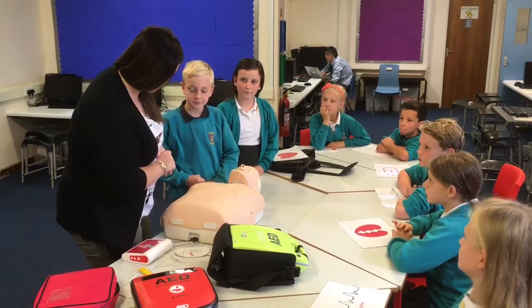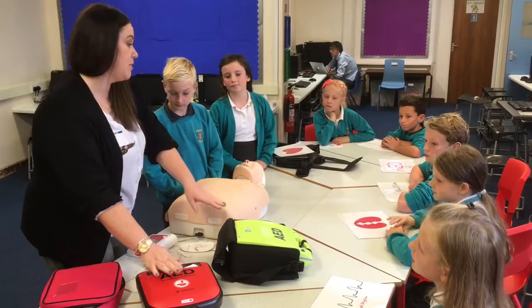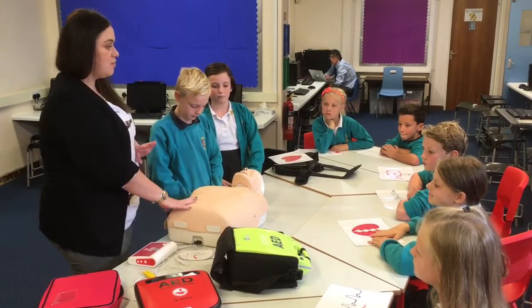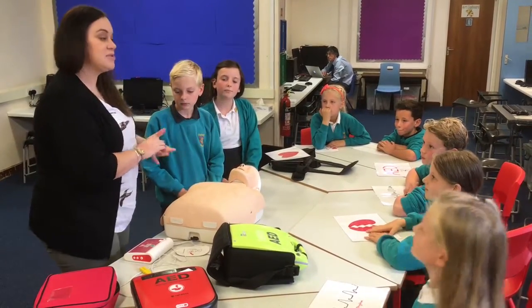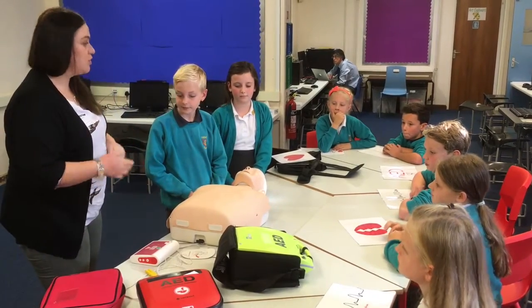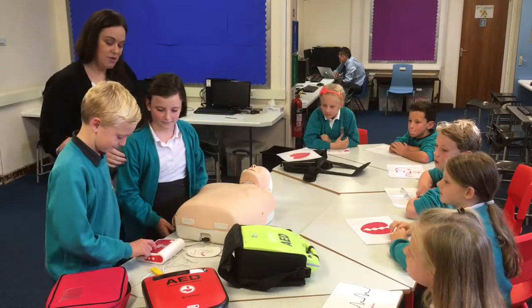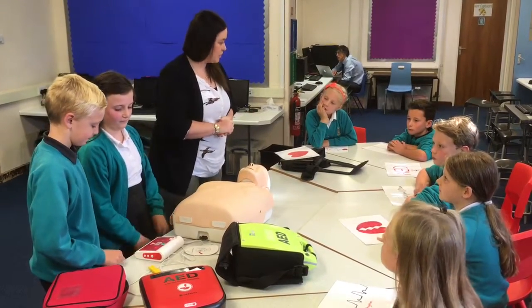Do you guys want to have a go at doing it and we'll work our way through? This is a training unit - these are your real ones but this is our training unit. Obviously we can't use these on the doll but we can use this training one. Let's just say this person has collapsed and stopped breathing. We get the defibrillator and we now need to use it. So you switch it on - and then you just do what the machine tells you to.